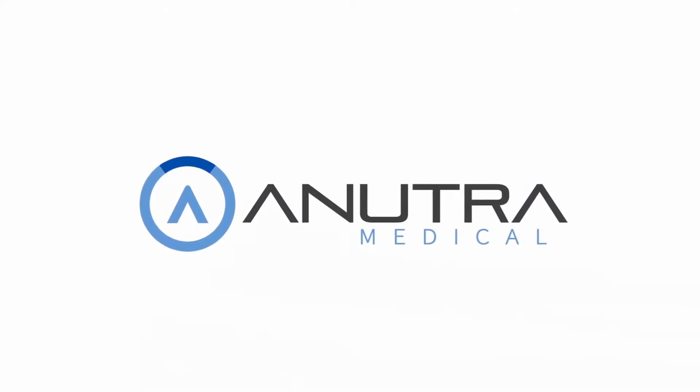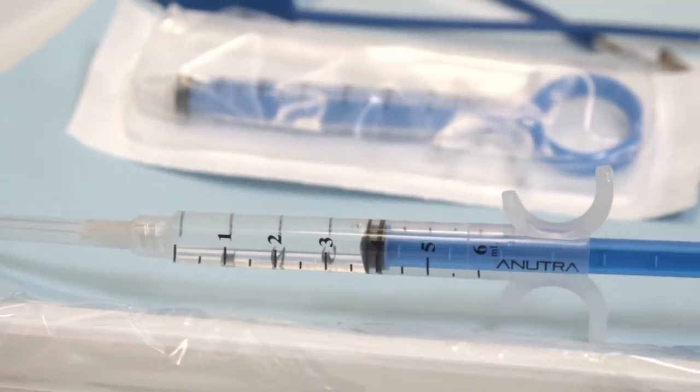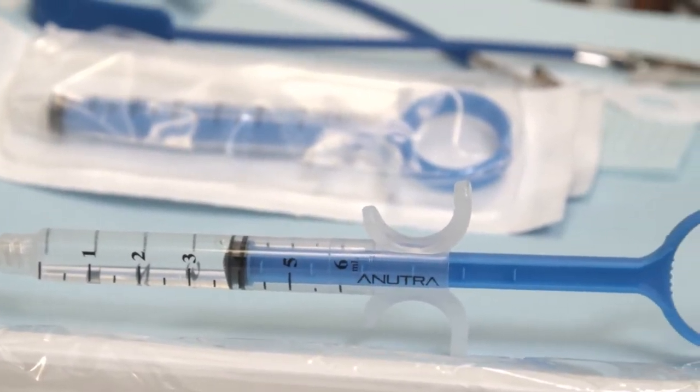There is no comparison between a traditional dental syringe and the Anutra syringe. They're two different animals. It's two different worlds.